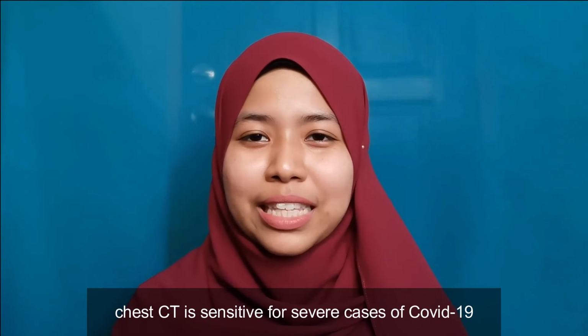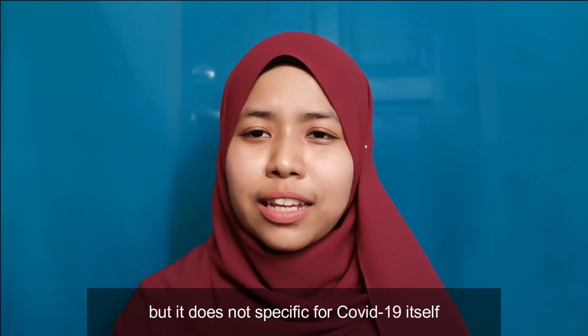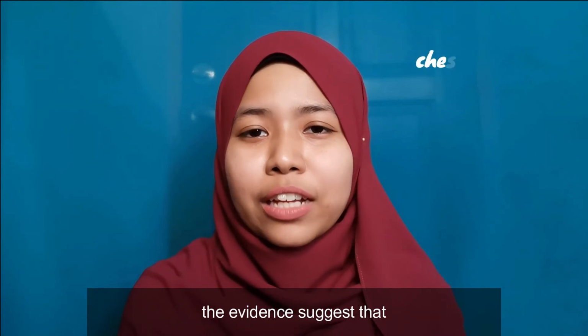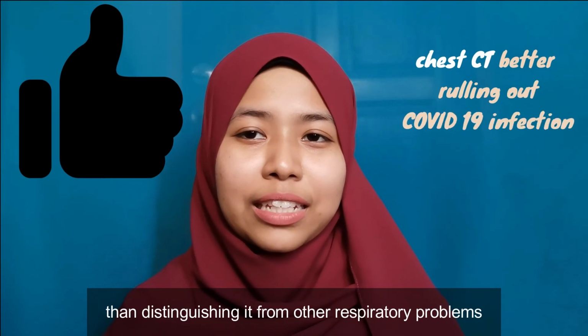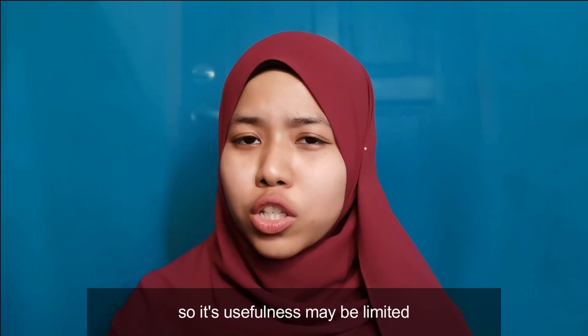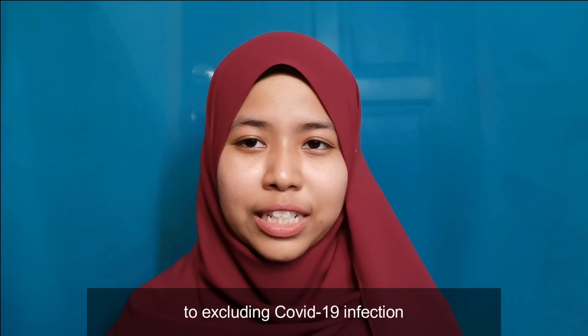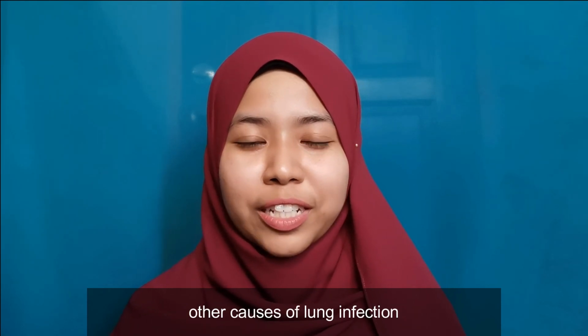Chest imaging is sensitive for severe cases of COVID-19, but it is not specific for COVID itself. The evidence suggests that chest imaging is better at ruling out COVID-19 infections than distinguishing it from other respiratory problems. So, its usefulness may be limited to excluding COVID-19 infection rather than distinguishing it from other causes of lung infection.